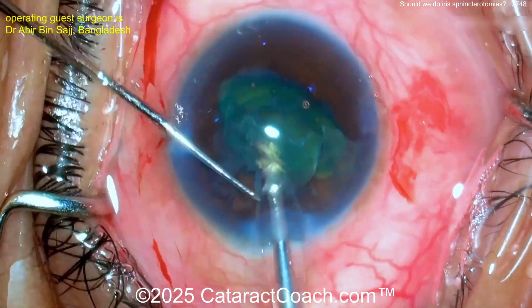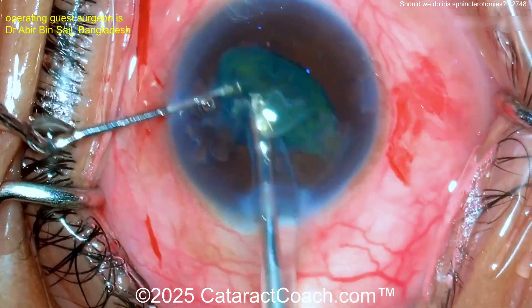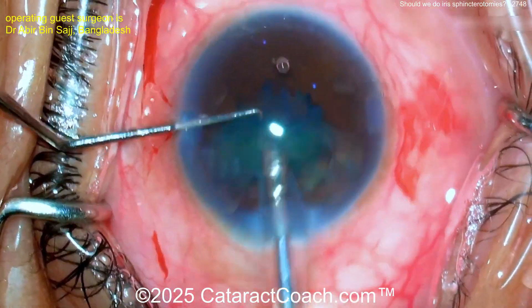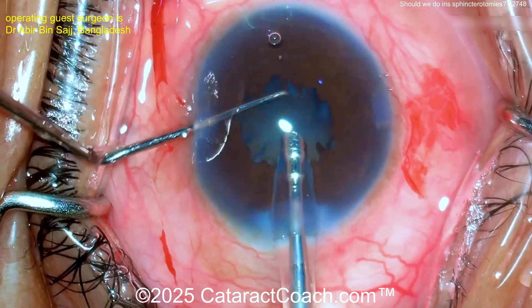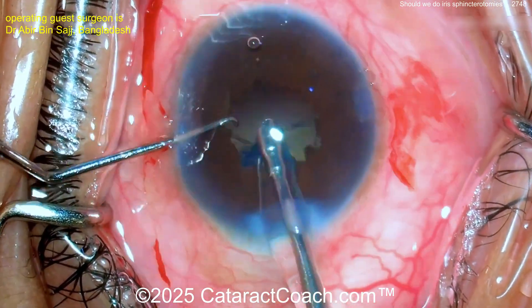Remember: at the end of these cases when the pupil doesn't dilate well, I like to lift up the iris to make sure once the IOL is in the bag — and before removing viscoelastic — that one, the IOL is totally in the bag, and two, there's no retained lens material in the capsular bag. That looks pretty good. Now probably switching to an IA Pro would be the best bet at this point.